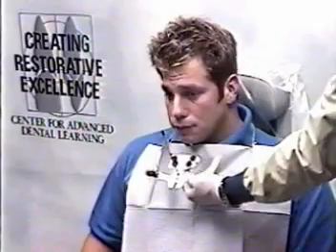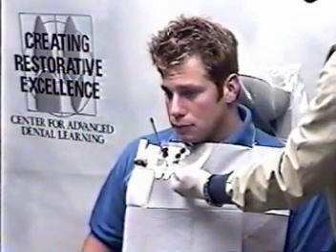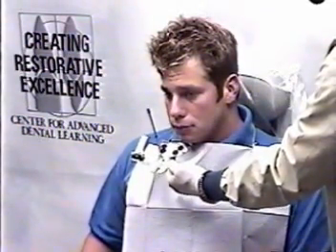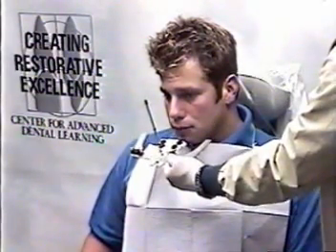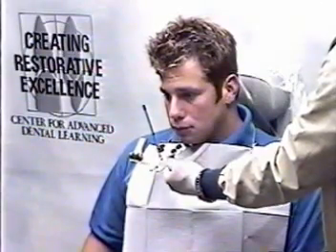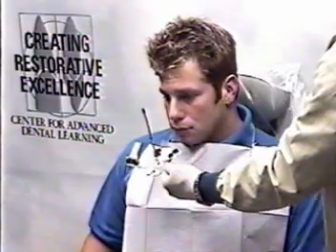Once removed, it's so much easier because there is nothing in the patient's ears. It's much less cumbersome, and patient acceptance is much easier. As you can see, there are no screws required to position this bow, so no additional tools are necessary for this procedure.